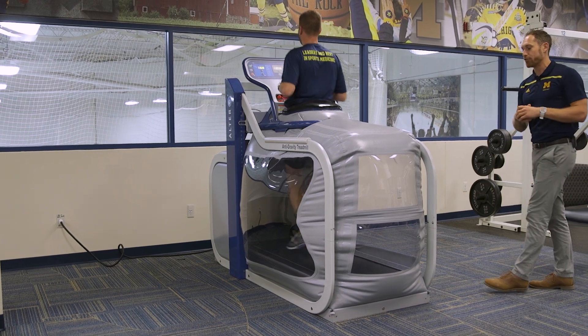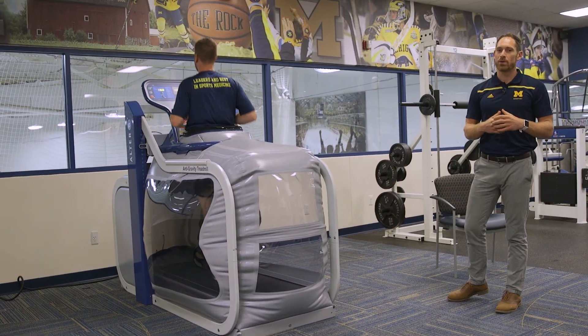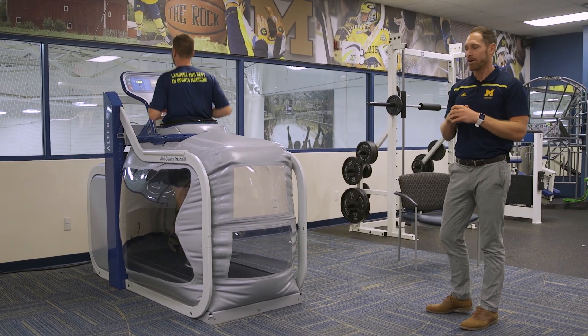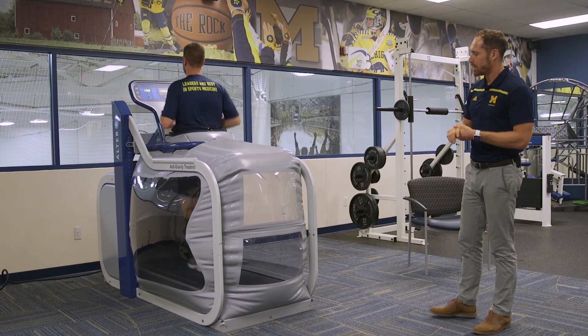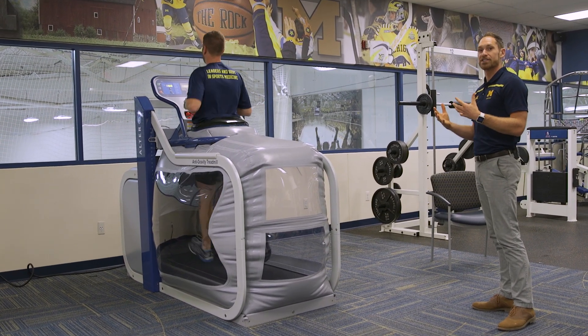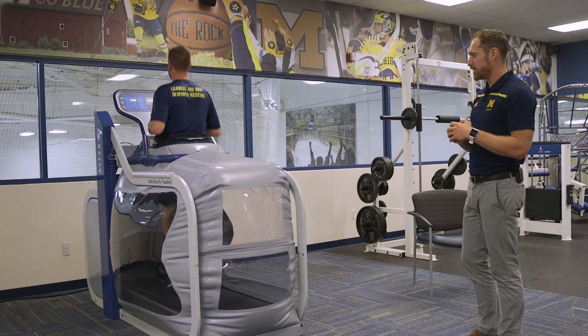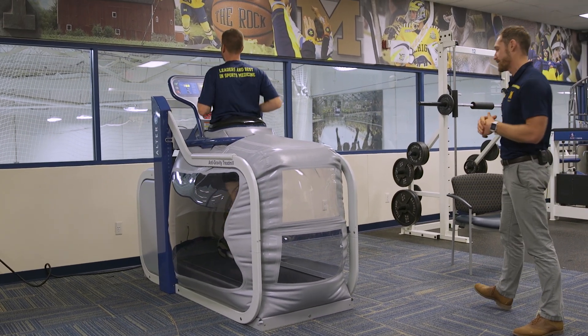Typically I'll take a look at their form just to make sure. A lot of people in that unweighted environment will almost hit too much of their toe, and you can just tell that their mechanics are different. So we look at that, ask the patient how they feel, and see if they feel like their mechanics are as normal as possible.